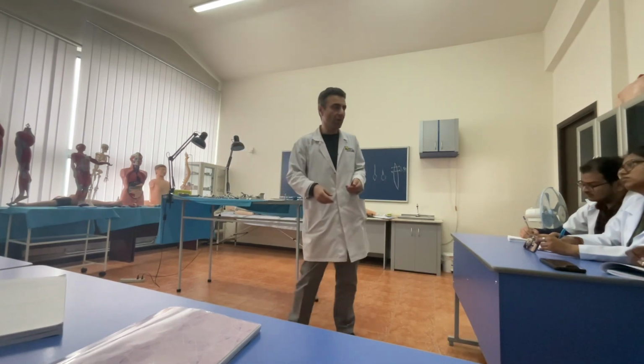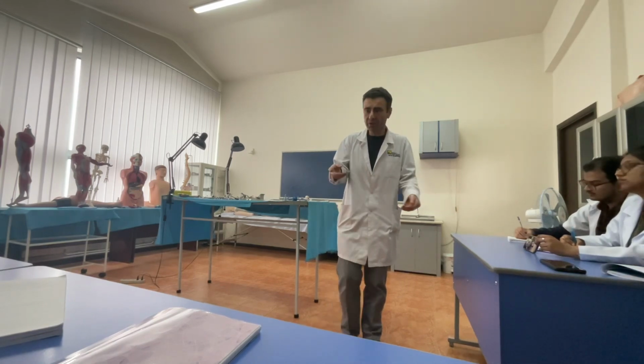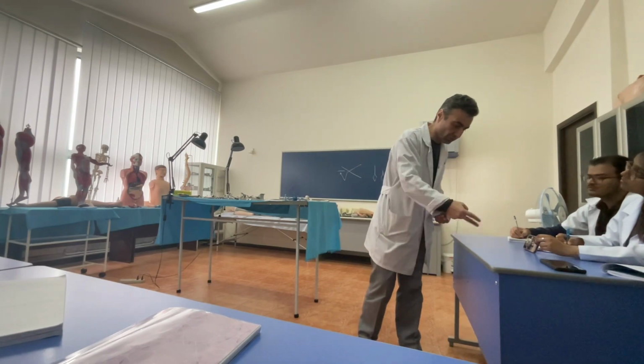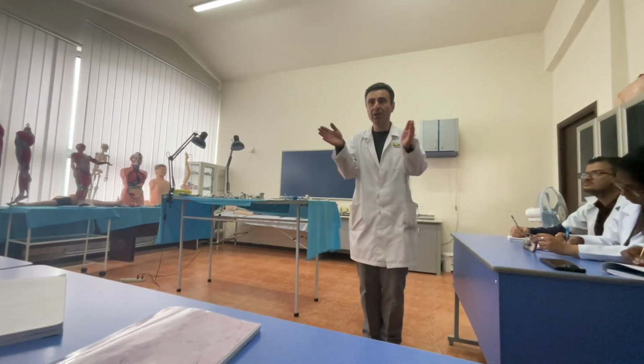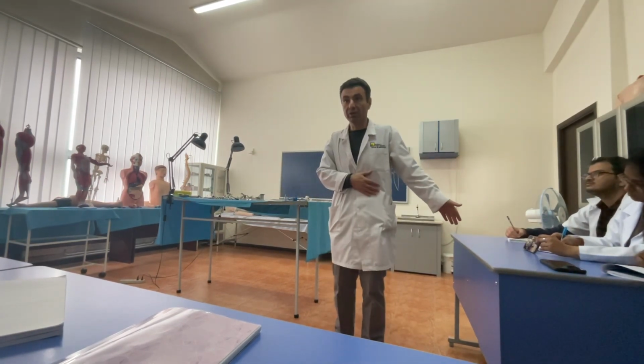What does it mean, arresting of bleeding temporally inside of the wound? It means clipping of vessels. I take arterial forceps inside of the wound, I find the bleeding point, I apply arterial forceps at this point, it clips the artery, and for some time it arrests the bleeding.